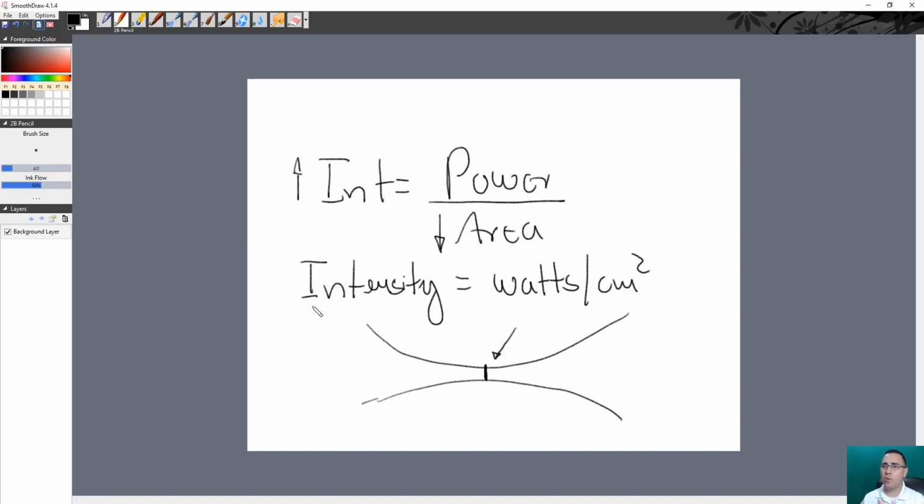And then of course the power, which is our next parameter. Power is basically the work performed by the wave. But this sounds like a scientist, right? It's better to say that the power is just how strong your wave is as well. So those 3 parameters say the same thing about the wave. They say, hey, this wave is pretty strong. This wave has a lot of intensity, a lot of amplitude, a lot of power.